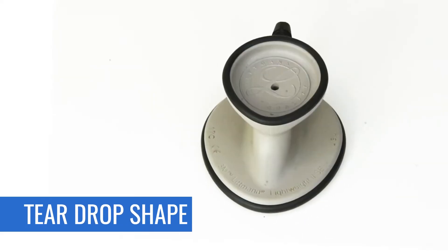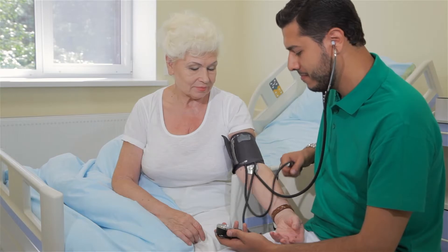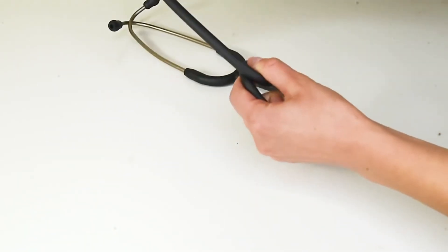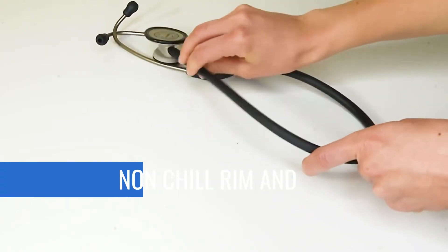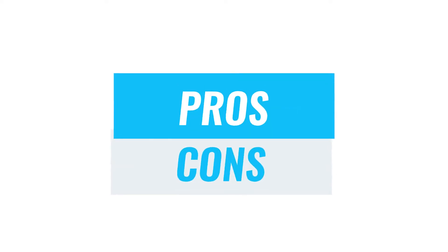With its teardrop shape, you can easily fit it in the patient's cuff for accurate blood pressure readings as well. To cater to paediatric assessments, this stethoscope is designed with a non-chill rim and latex-free tubing for comfort and allergy prevention. Let's look at some of the pros and cons.